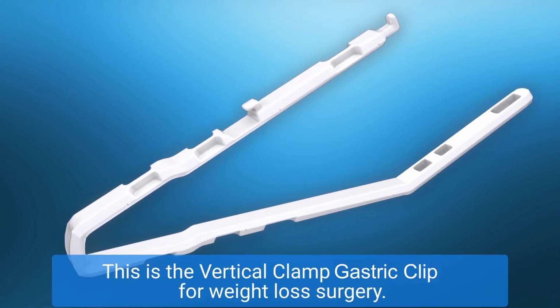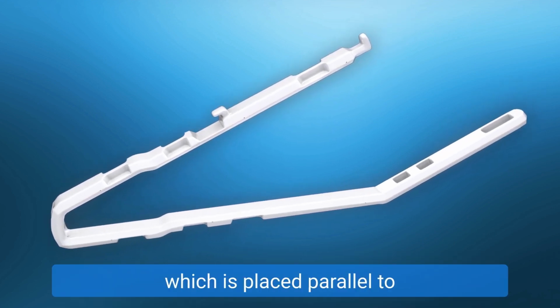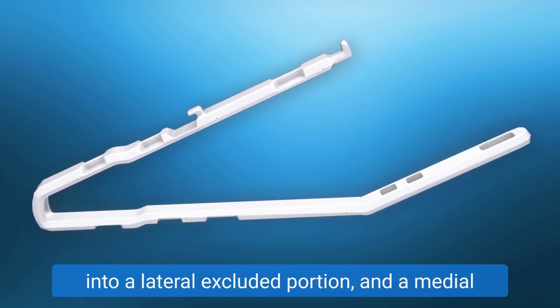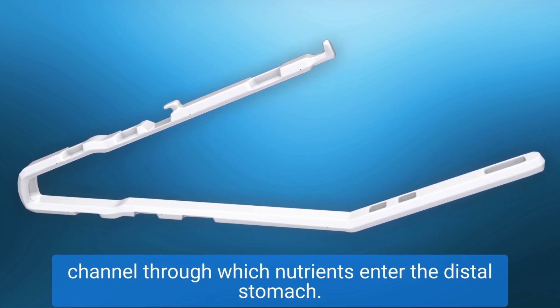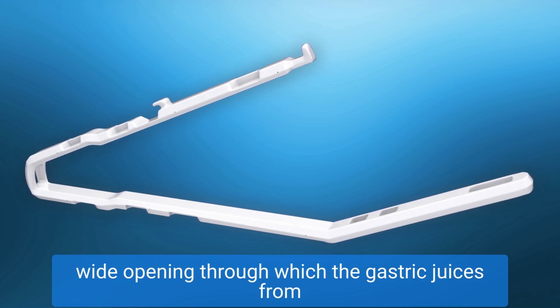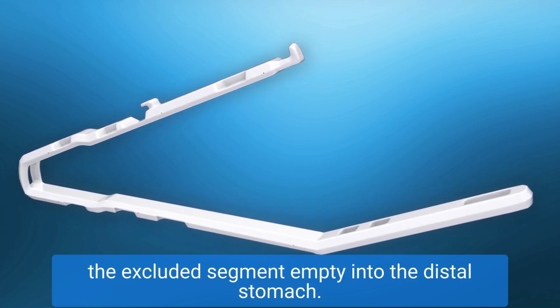This is the vertical clamp for weight loss surgery. It is a silicone-covered titanium-based clamp which is placed parallel to the lesser curvature and separates the stomach into a lateral excluded portion and a medial channel through which nutrients enter the distal stomach. The inferior portion of the clamp has a flexible wide opening through which the gastric juices from the excluded segment empty into the distal stomach.